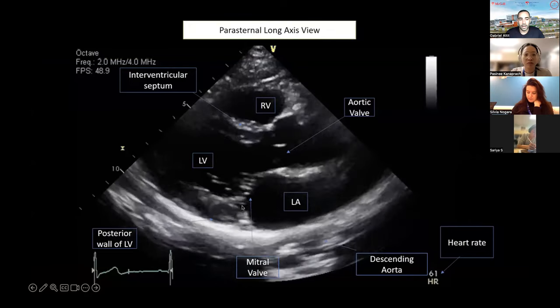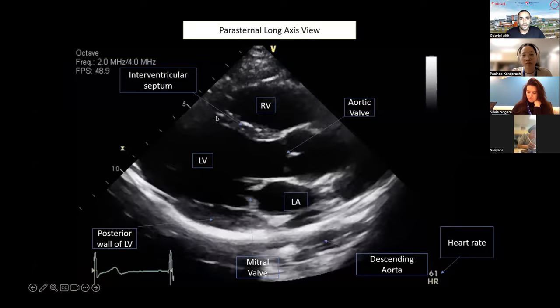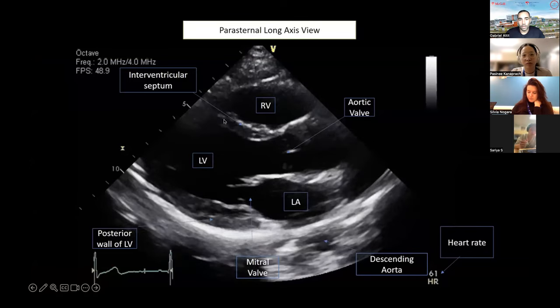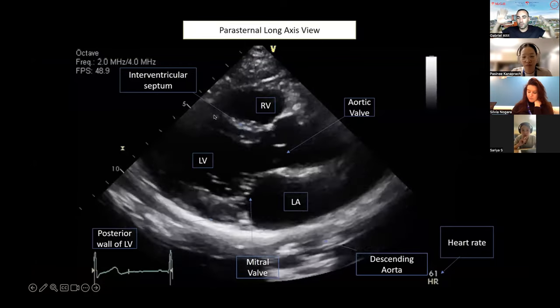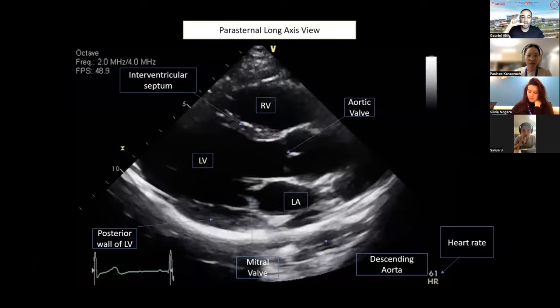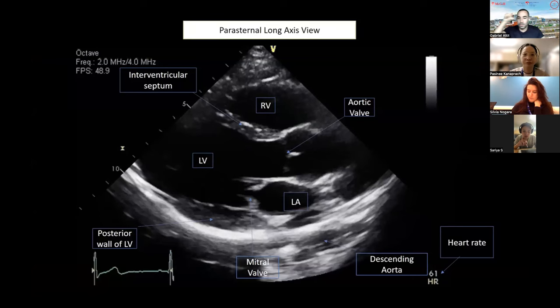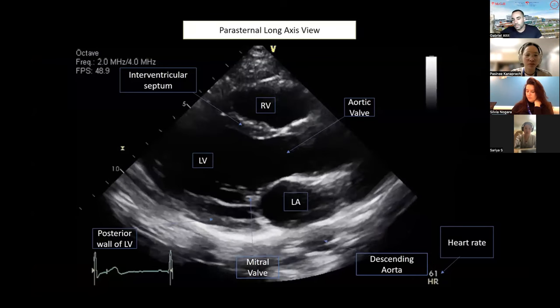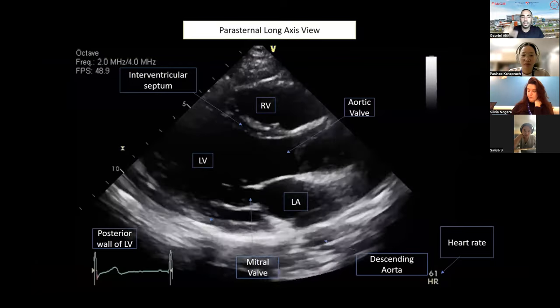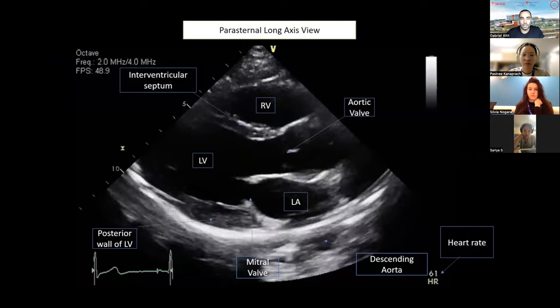So these are just to orient you to the image and to some of the information you do get on the echo images. On top, you have the right ventricle. Here you have a portion of the septum. So the septum is a wall. Think of a wall as a very complex 3D structure. Here we're just cutting the wall in a really short segment. You could be moving along the wall in so many places, right? And you can also go up and down, right? And here we're just taking one segment in 2D.